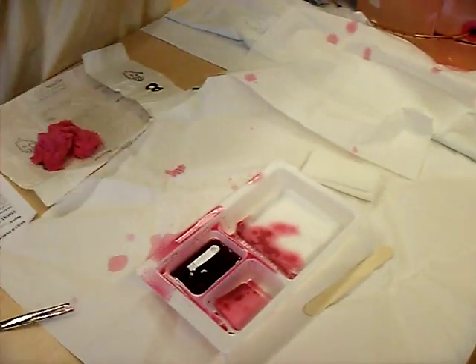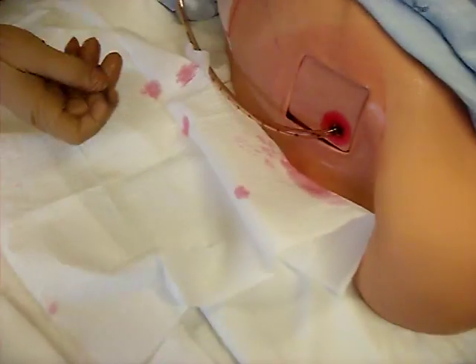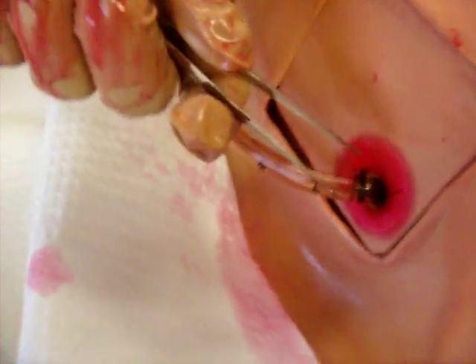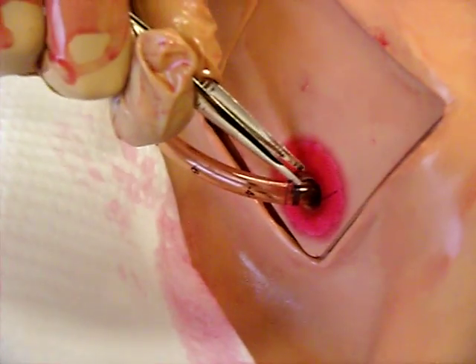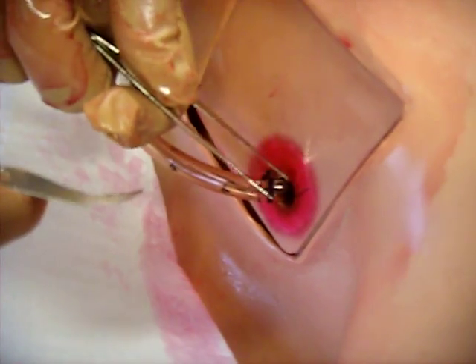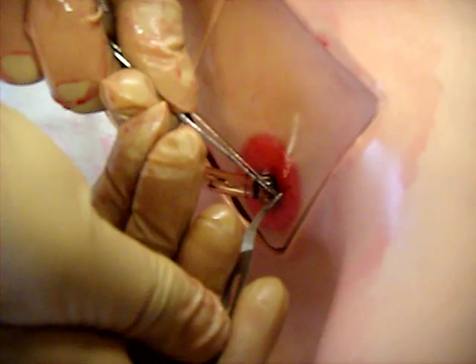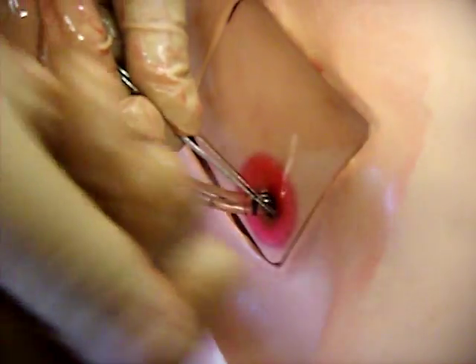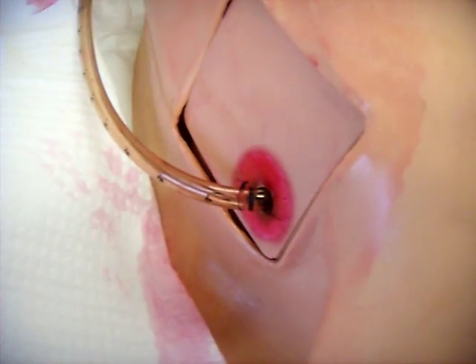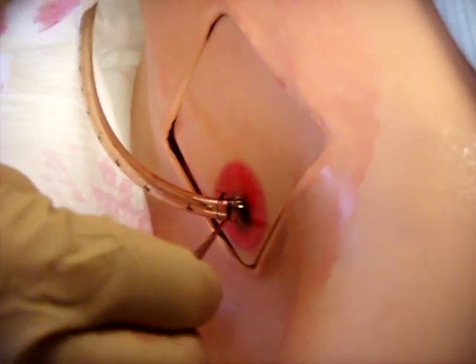We've already discussed your breathing pattern, Mr. Smith, so what I want you to do now is we're just going to go over that while I gently remove this suture. So the first thing you want to do is make sure that you're going to take some deep breaths in and out when I tell you, so I'm just going to go through it with you again, so you can use this opportunity to do your teaching. Once you find your suture where it enters the body, you want to slit it close to the skin, as I said, and then if you're removing the suture, you're going to pull it out under the skin and back out the other side.